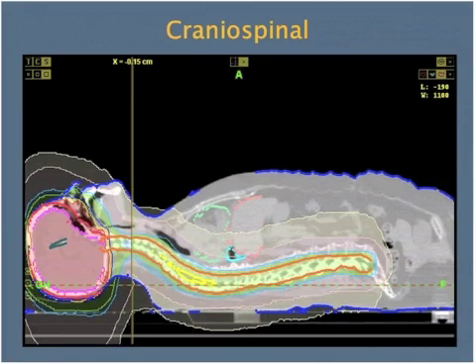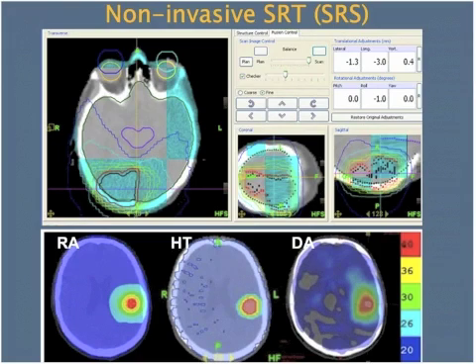We also now have the flexibility to deliver craniospinal irradiation very efficiently. Tomotherapy is a fairly slick platform for doing that, but any of the image-guided intensity modulated platforms will allow us to do high-quality craniospinal radiation. And we can get even more fancy, and here we have reirradiation of a glioma in the posterior fossa or in the occipital lobe with a hypofractionated technique using daily image guidance.